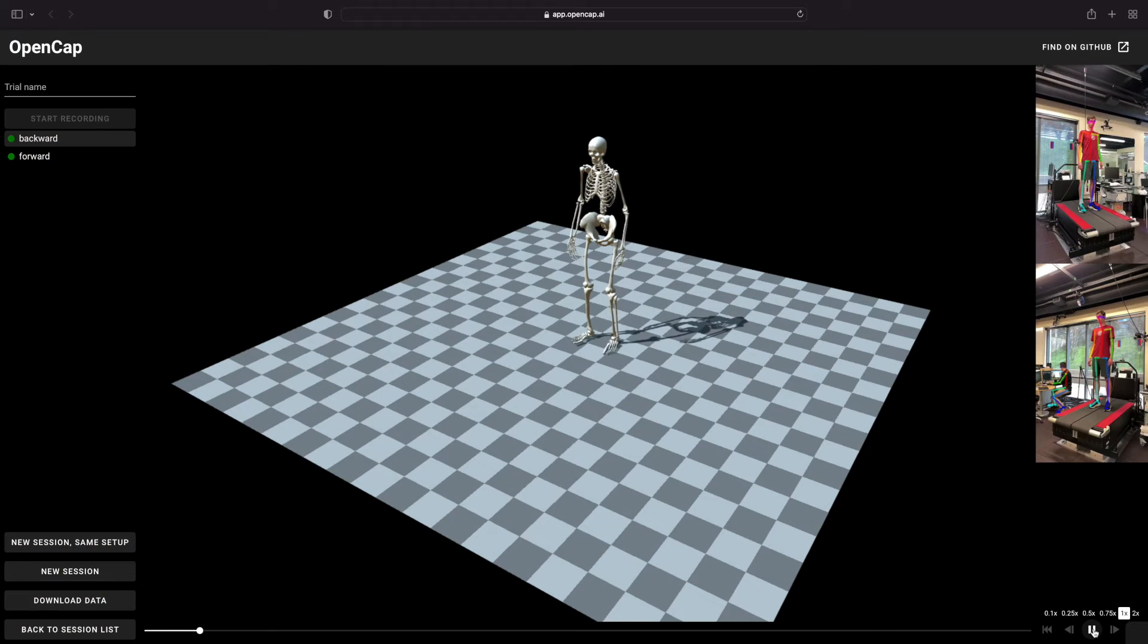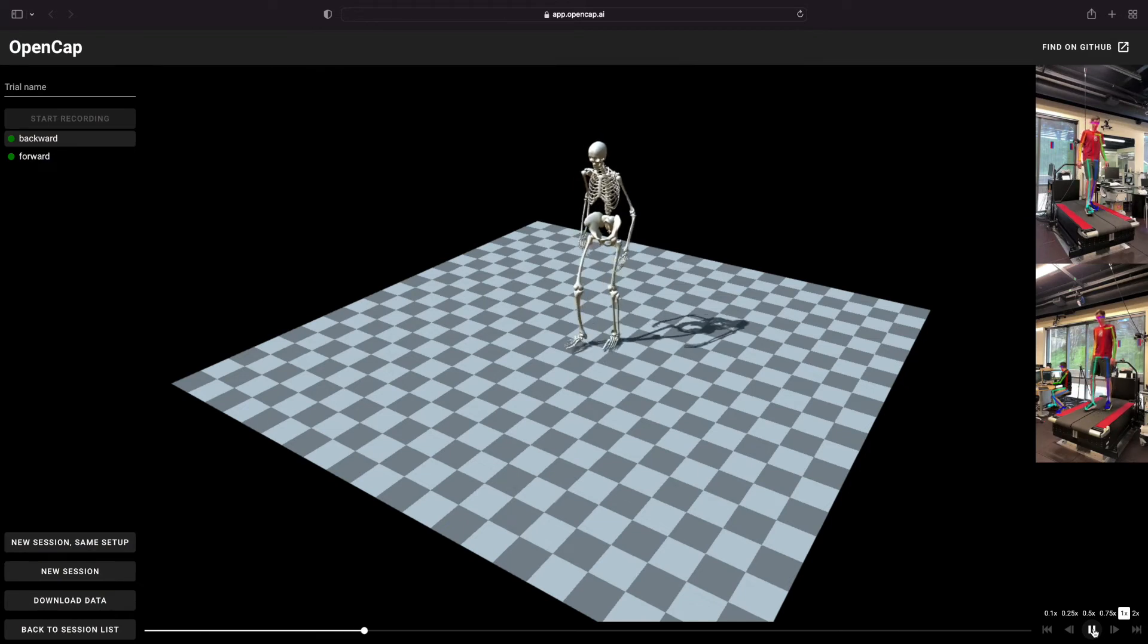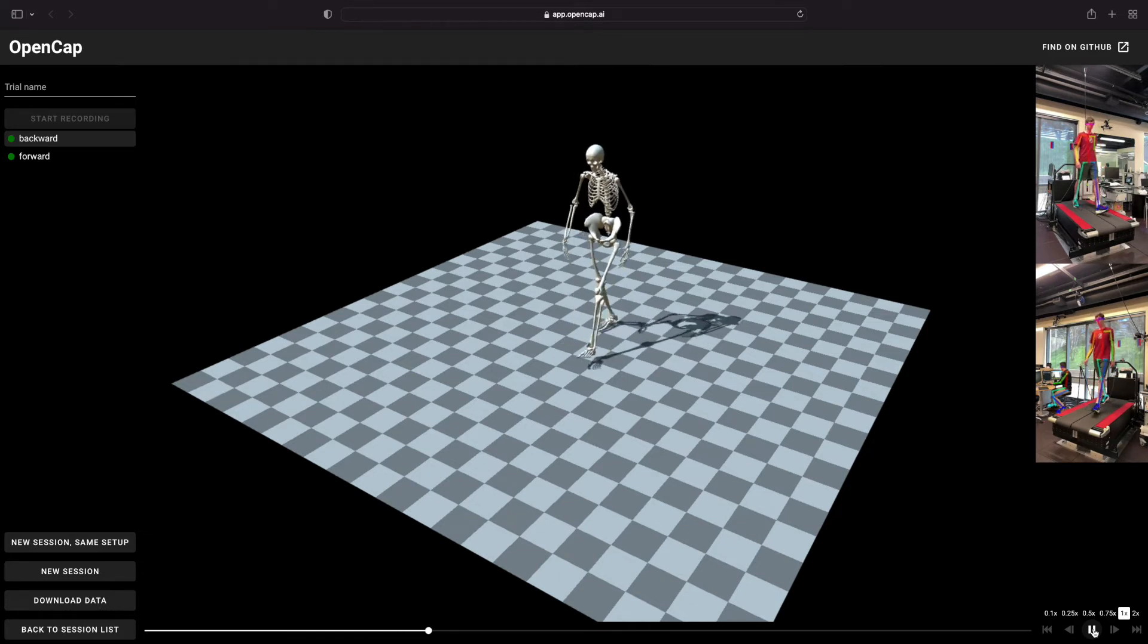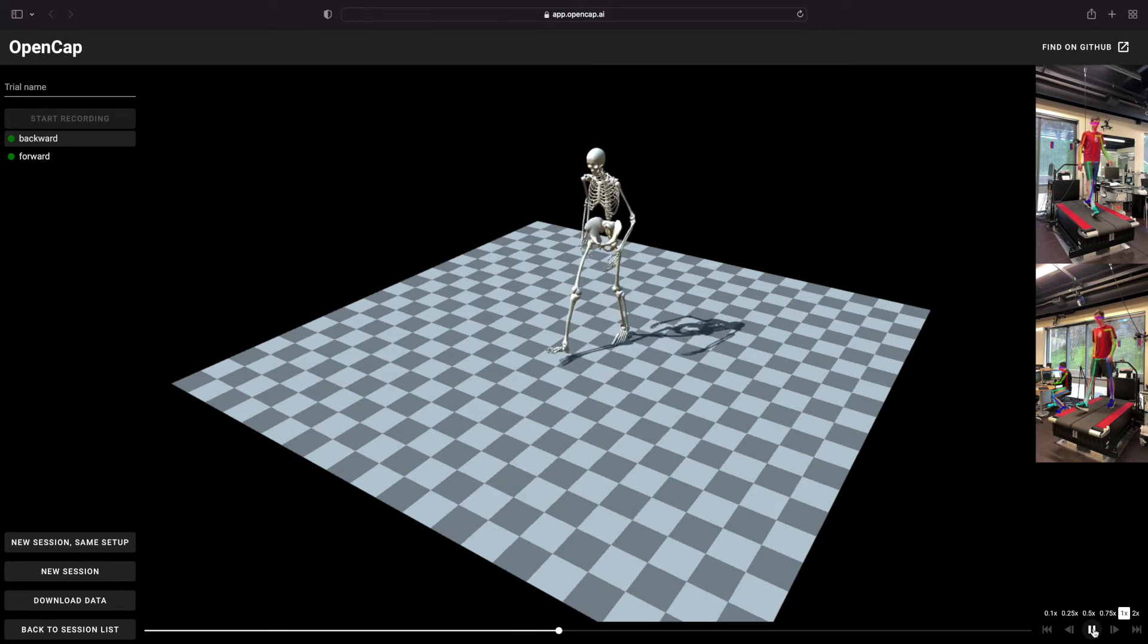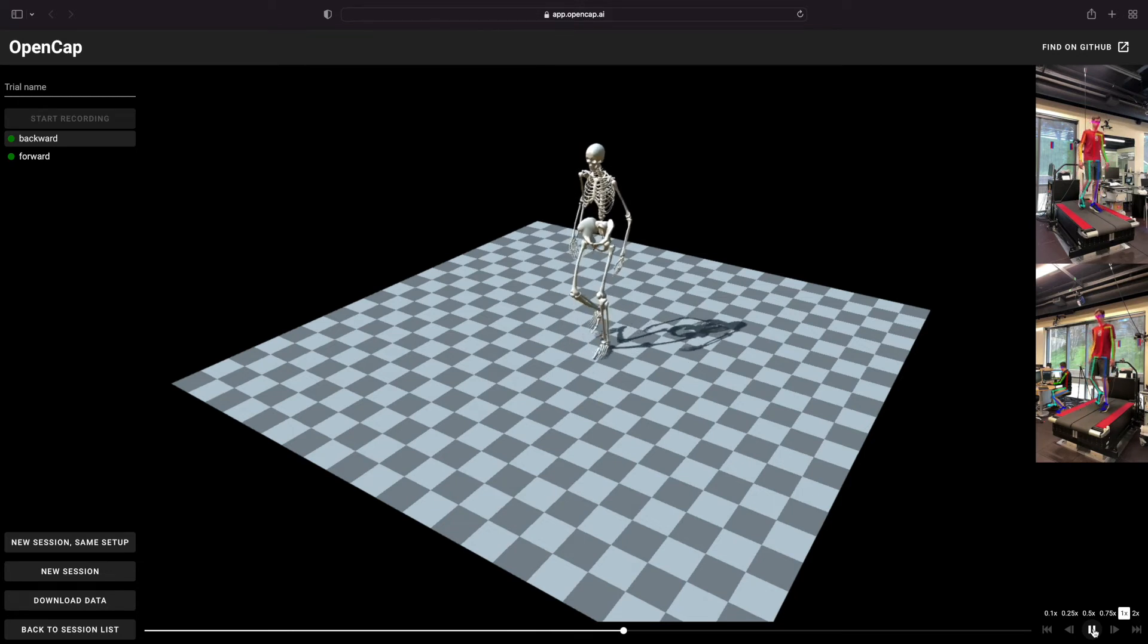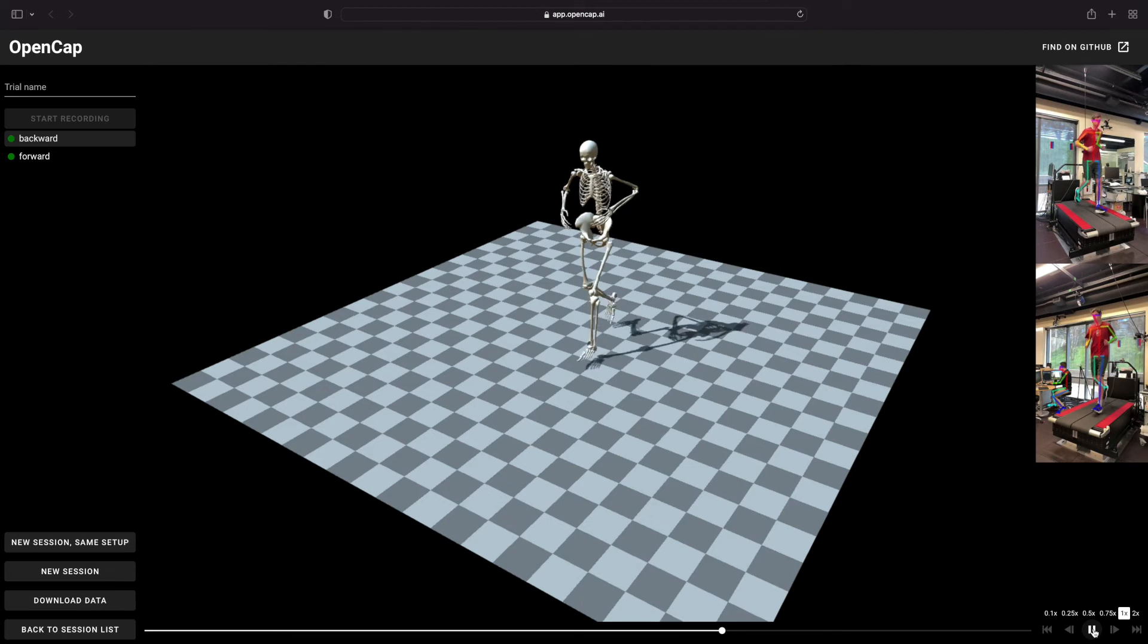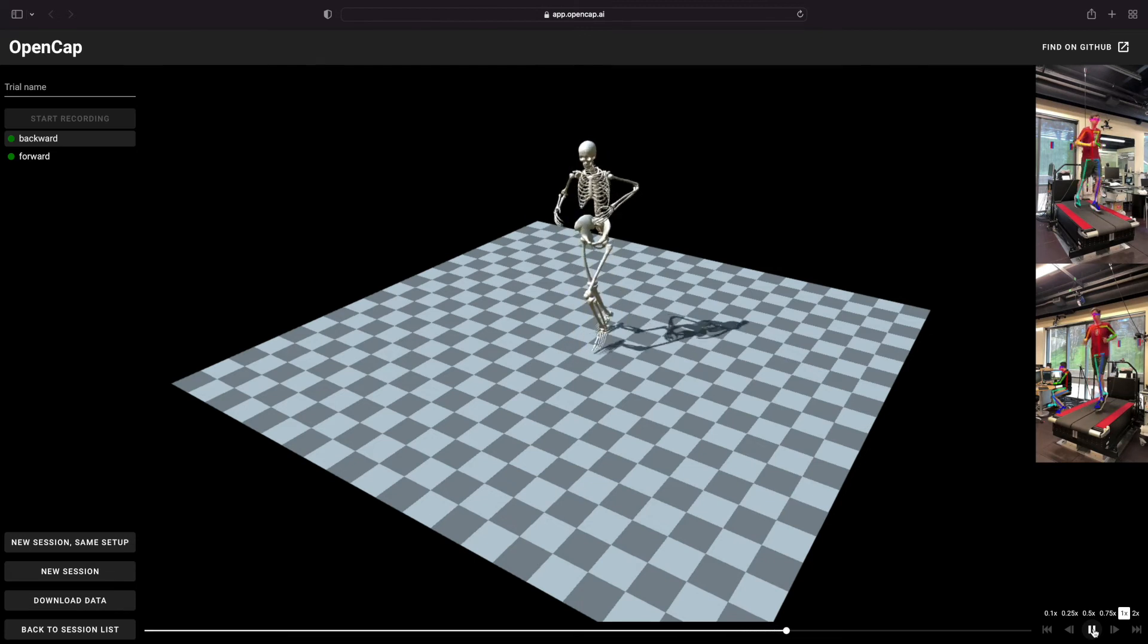After collecting the trials, they will be populated in a trial list on the left. The color of the dot indicates the status of the trial. Orange indicates that it is still waiting to be processed in the cloud. Green indicates that processing has finished. Red indicates that there has been an error and you may want to recollect that trial.